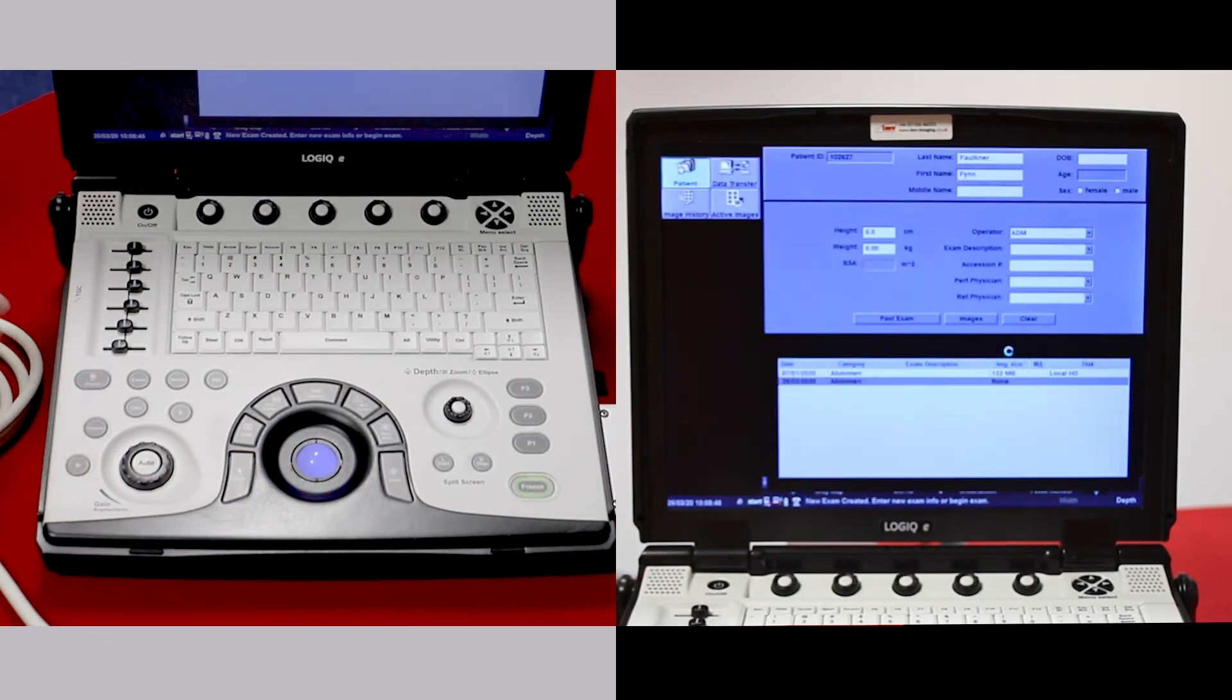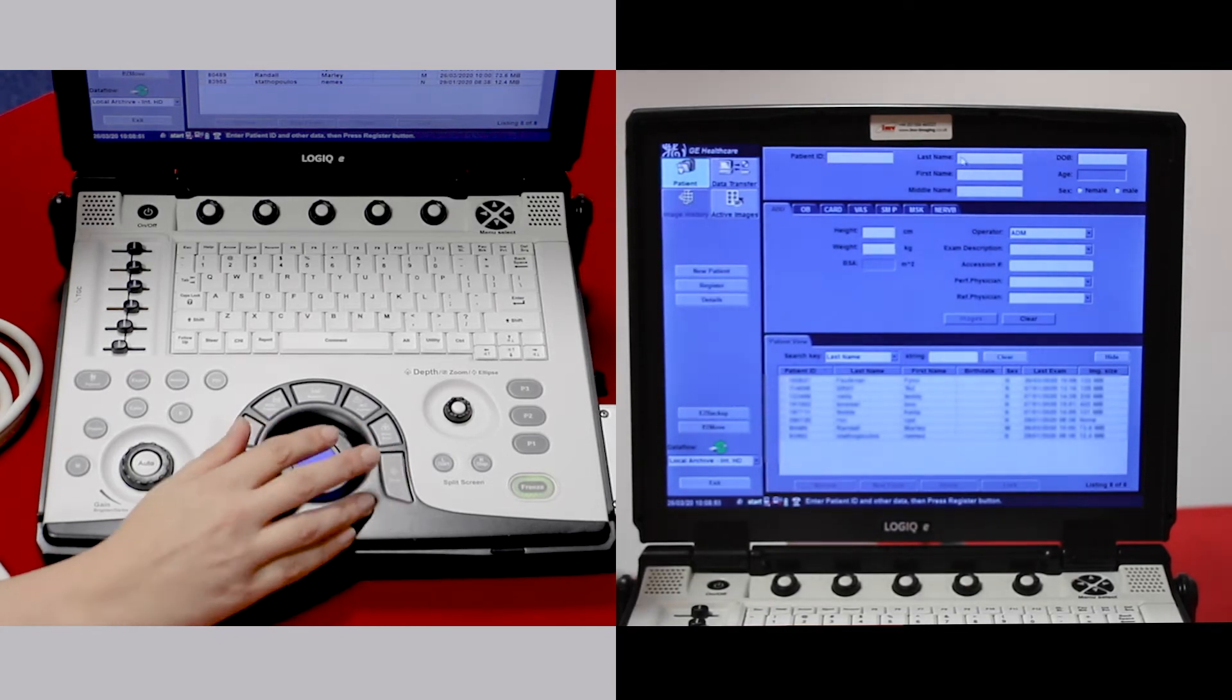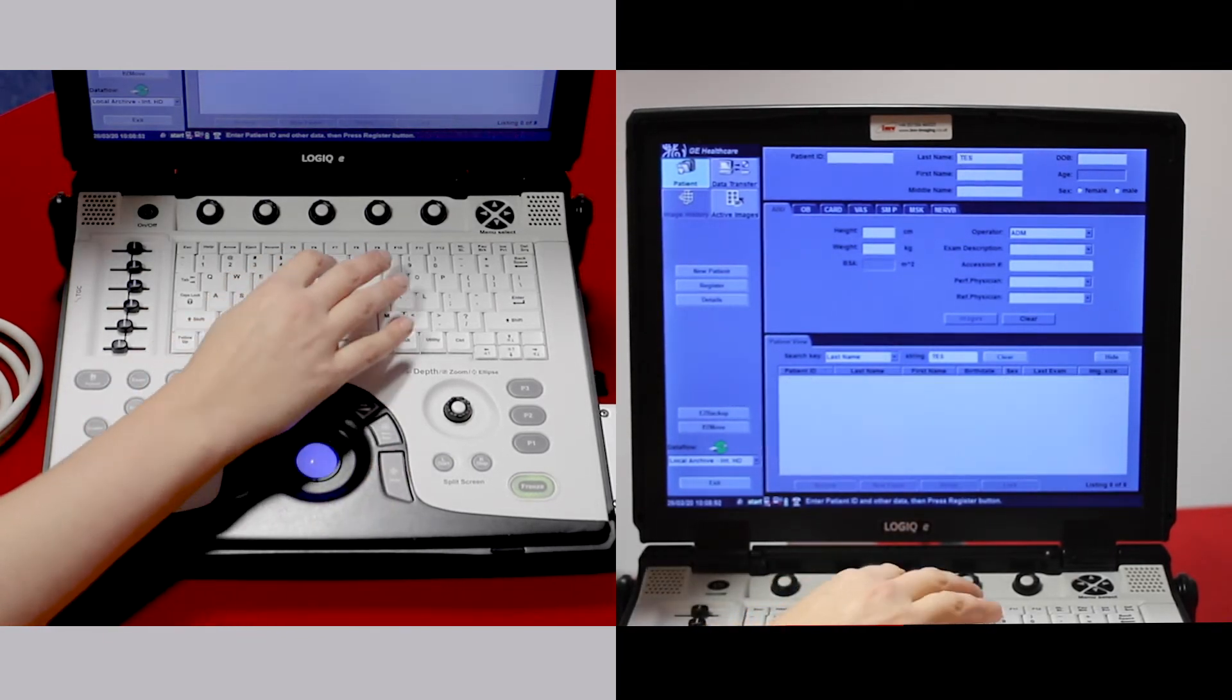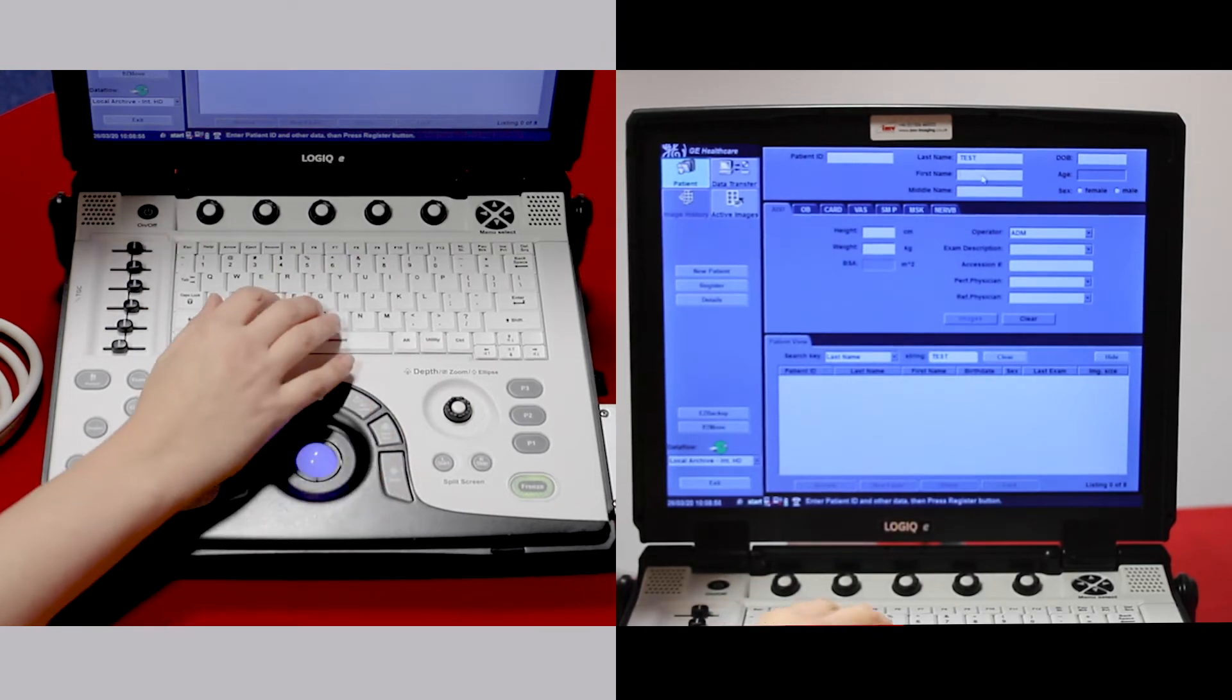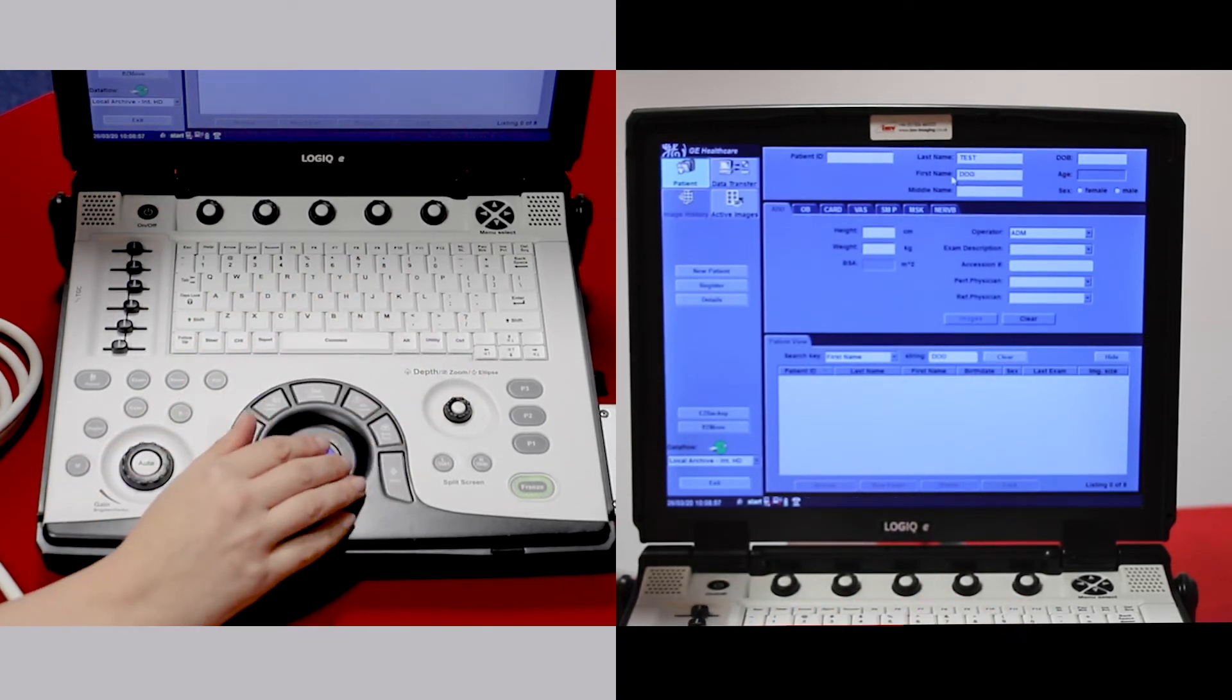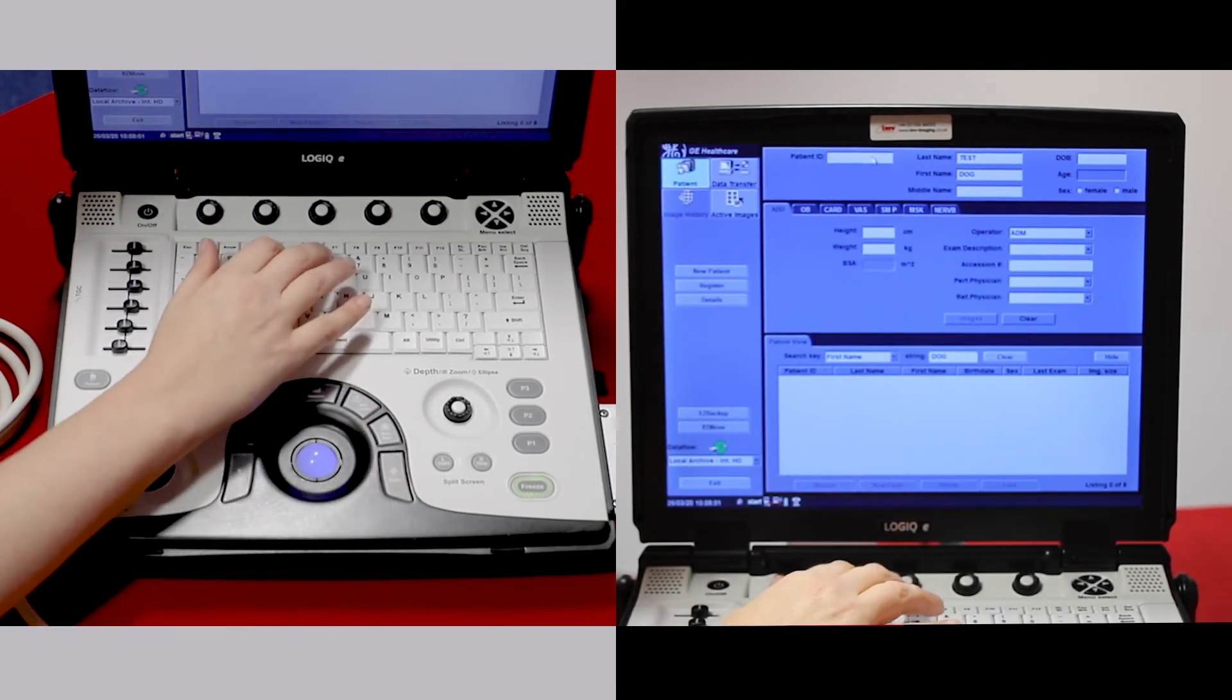If however you haven't scanned that animal before, you just need to put in the animal details. Always put in the animal name, client surname, and a patient ID.